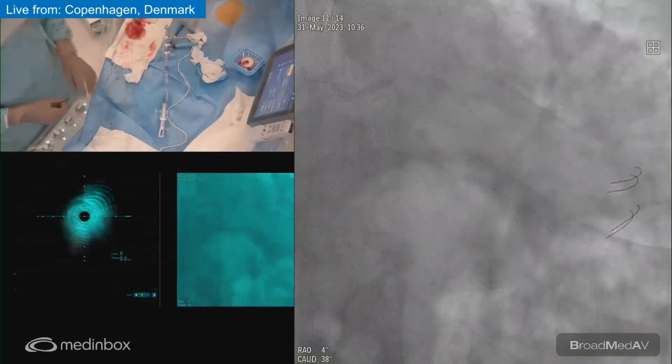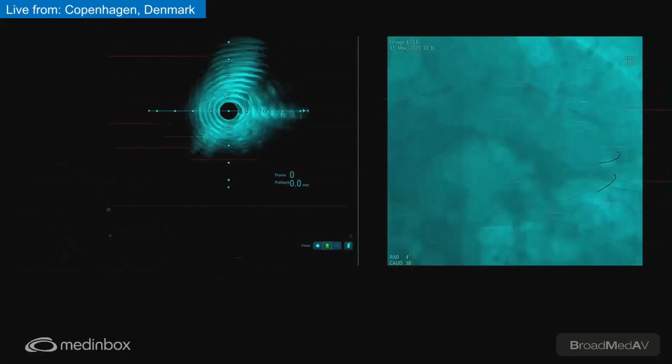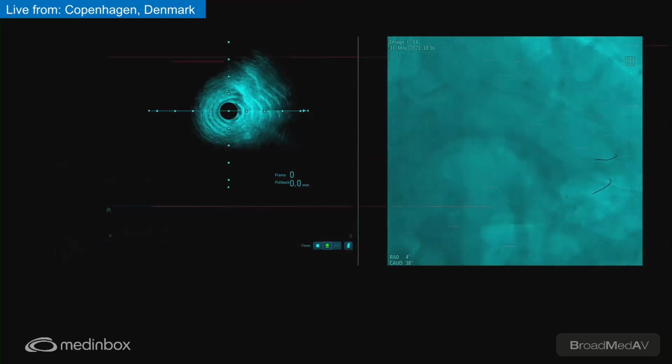Try to go live. We just bring the catheter down once again here.